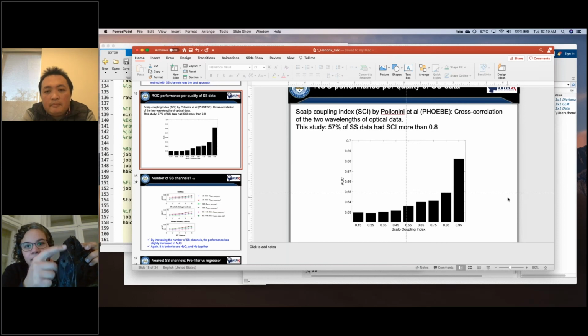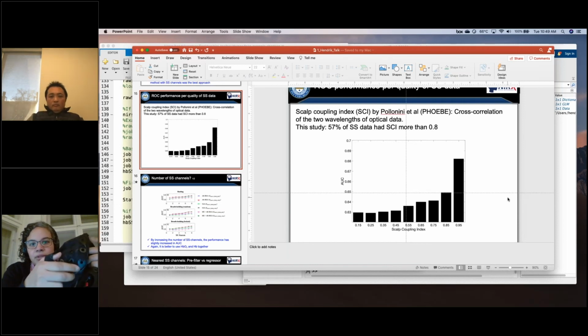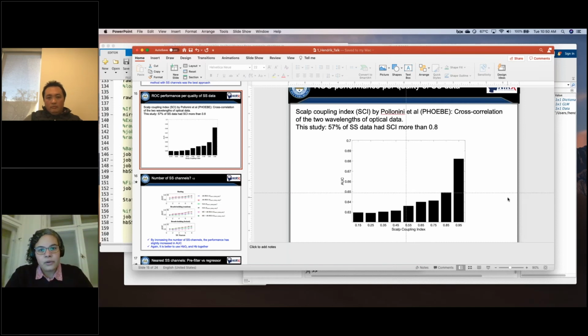Usually, one good idea is to get the cable management inside of the cap, so you don't have the cable of the short channel going into a source, for example, or blocking a detector. So having good cable management in the inside part of the cap is a good idea. And of course, managing the hair out of the short channel is another one. Combining both of these measures with very good coupling and adjusting the cap really well to the size of the head is also a good solution. But I don't know if you have any other tips, anything that you did that helped.